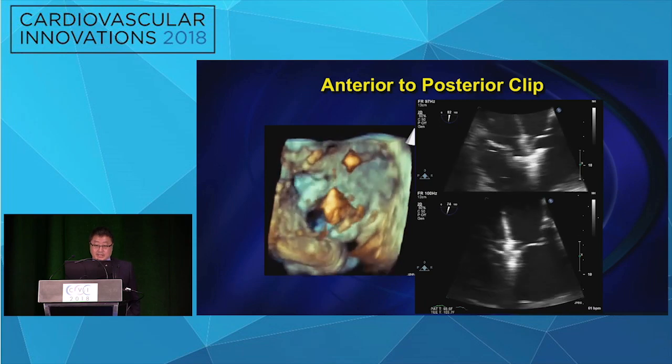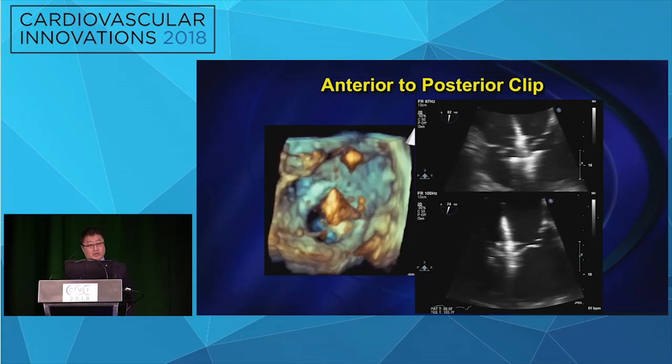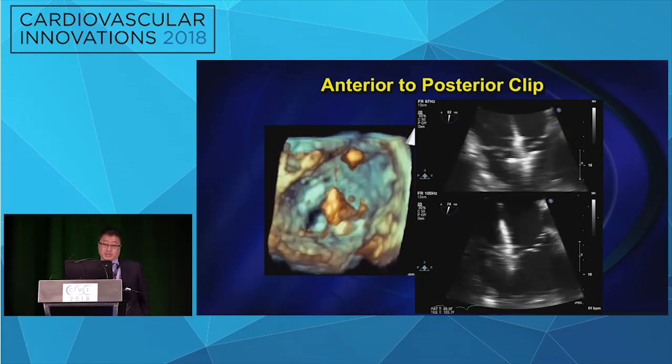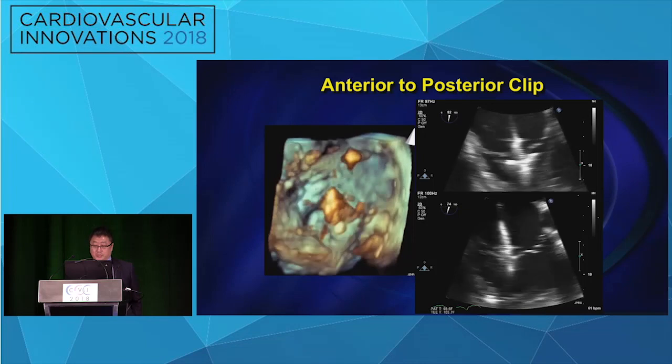It's about an 80, 75 degree view, tilting till you see the two leaflet pairs of the anterior and posterior leaflet. I think if you're lucky and from a transgastric view your clip arms are right in alignment with that commissure, you could use a transgastric X-plane as well.